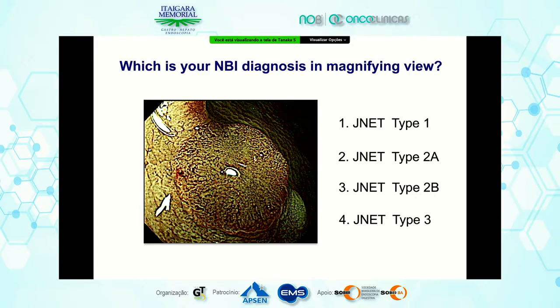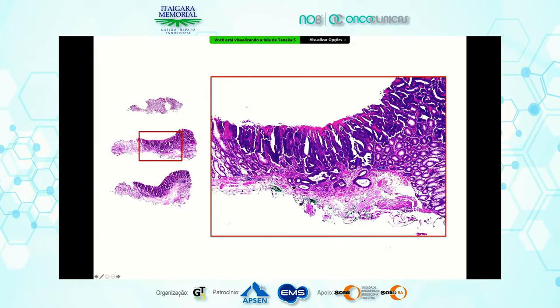Half of the doctors can diagnose correctly. This is type 2B. Type 3 is a semi-correct answer. Anyway, never type 2A. We conducted EMR. This is SM invasive carcinoma.